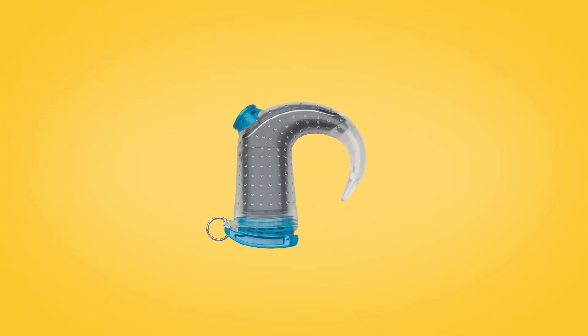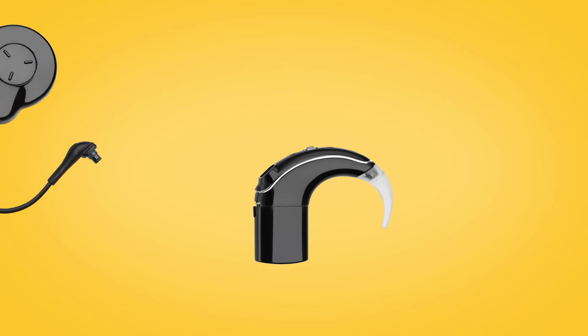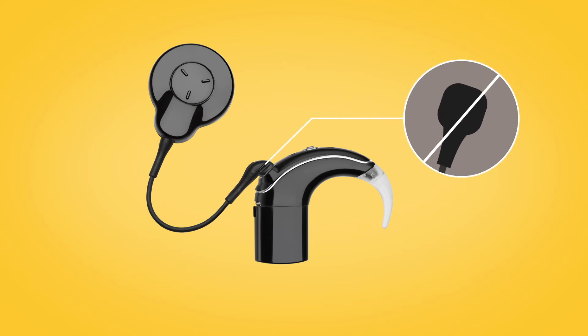Then open Aqua Plus and remove your sound processor. You can now reattach your usual coil by pushing the coil cable into the sound processor until it clicks, being careful not to twist.